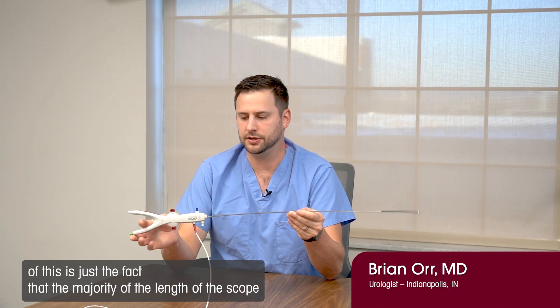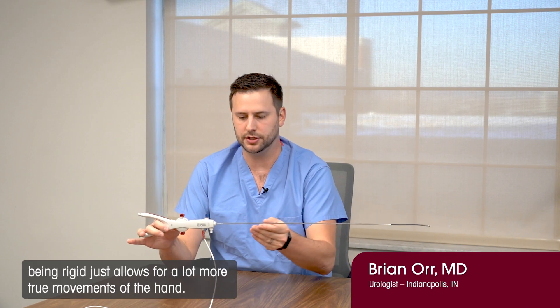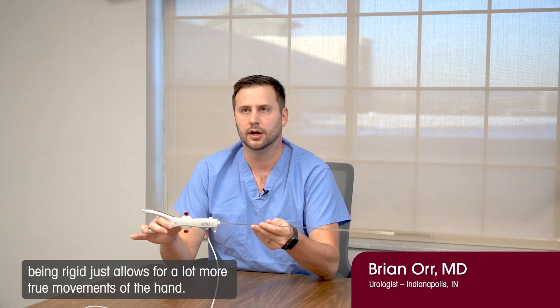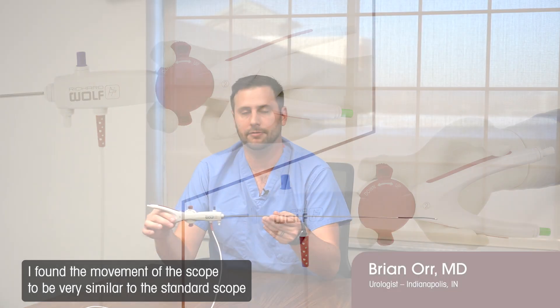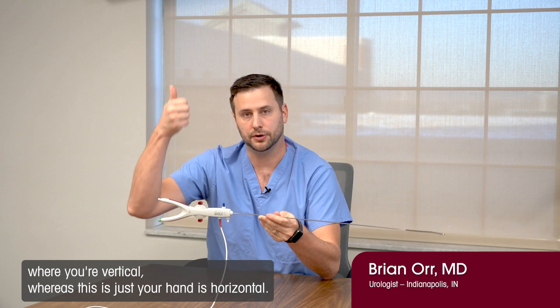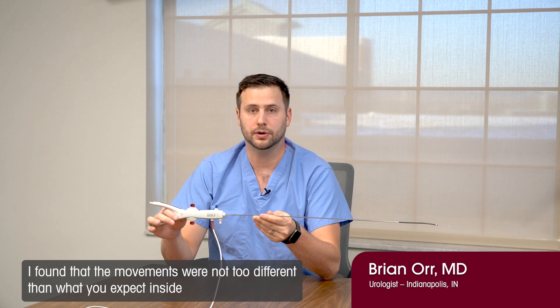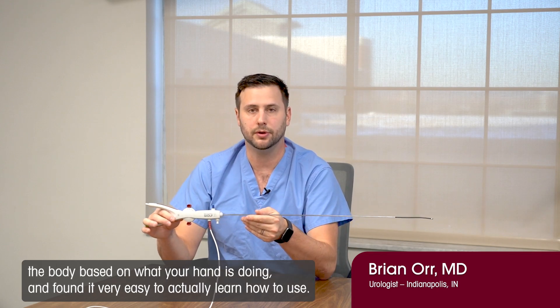One of the benefits of this is just the fact that the majority of the length of the scope being rigid allows for a lot more true movements of the hand. It does take some getting used to, but only about one or two cases. I found the movement of the scope to be very similar to the standard scope — where you're vertical, whereas this is just your hand is horizontal. The movements were not too different than what you would expect inside the body based on what your hand is doing, and I found it very easy to learn how to use.